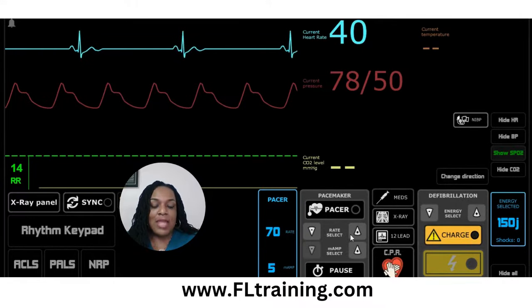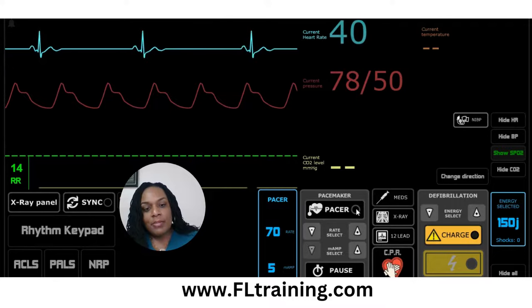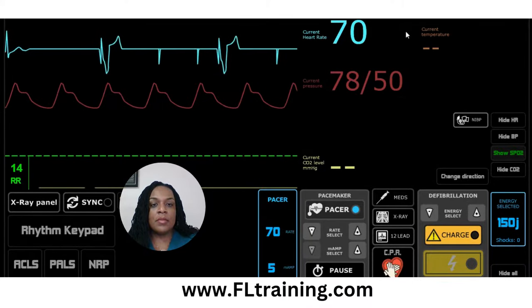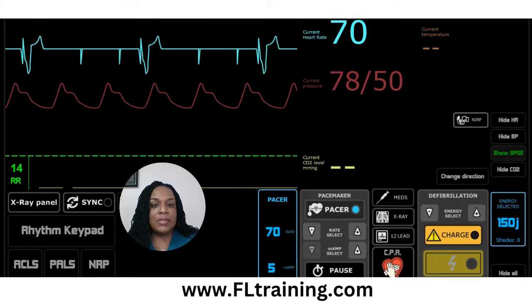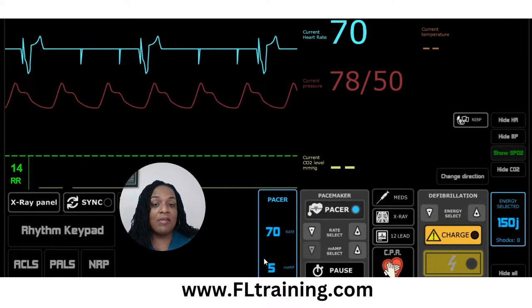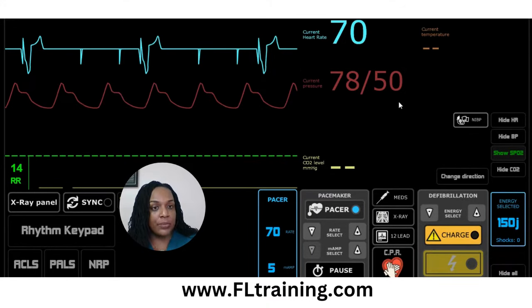Your manual defibrillator will have most of these same capabilities. Apply the pads — make sure the chest isn't too hairy, and if it requires any conduction jelly, apply that to the patient's chest. Turn on the pacemaker. Troubleshoot because we've set it at a rate of 70, but we are not seeing a QRS complex after each pacer spike. We have failure to capture. We fix that by changing our milliamps — the amount of energy going through the patient's chest wall. This is when it becomes really uncomfortable for your patient. If you're considering analgesics or sedation, always think about what that blood pressure is — we cannot give pain medications if the blood pressure will not tolerate it.